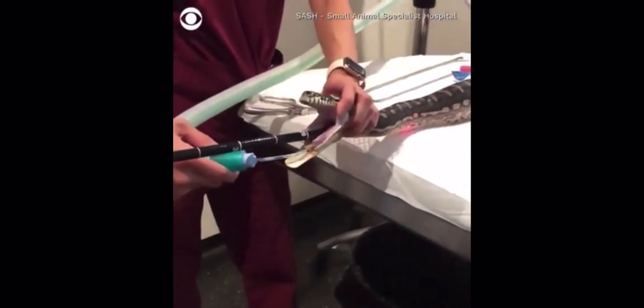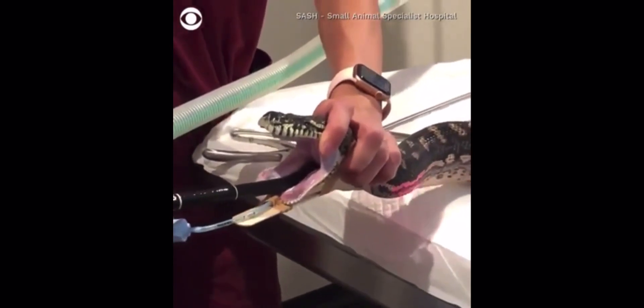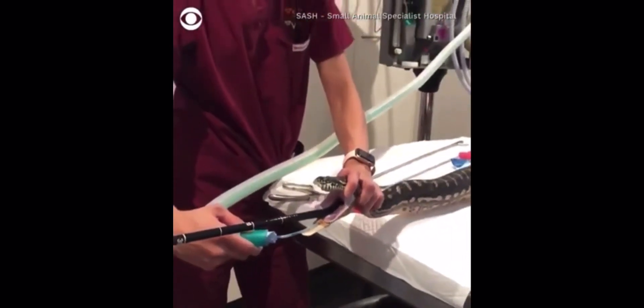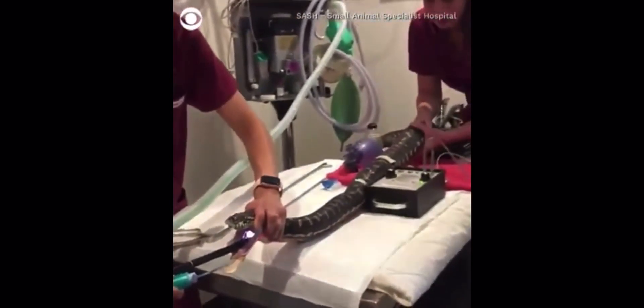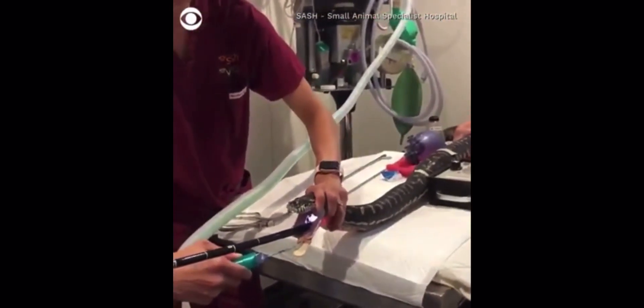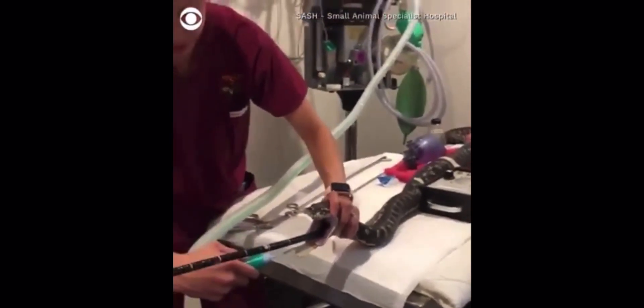You keep pulling the scope, you keep moving the chair. Coming out. Have you got like a common thread mover? Go back a bit. You're just like right... you keep pulling the scope actually.